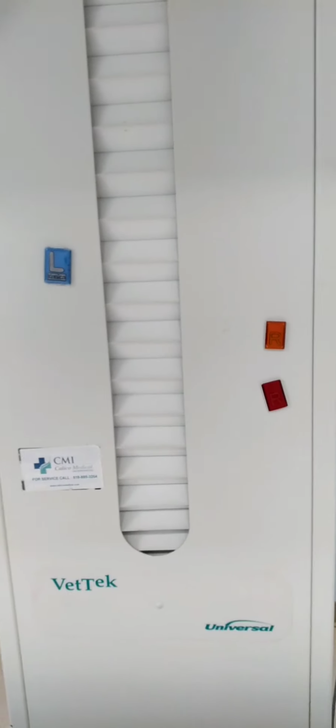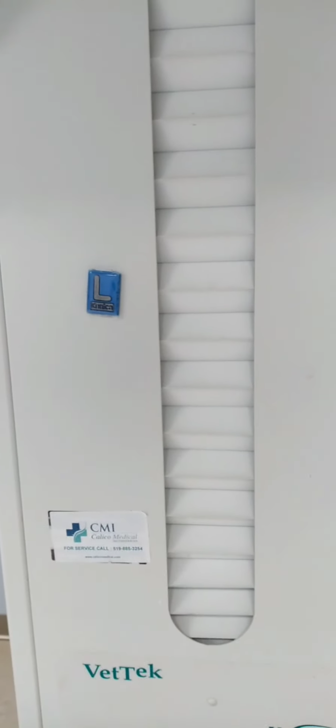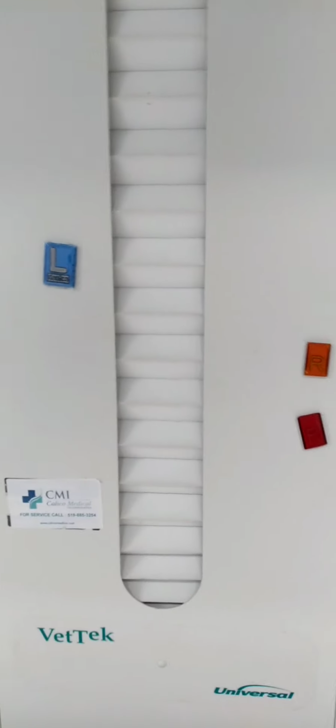Then the column is the back portion up here, all of this. On the column, you'll see there is one left marker and two right markers. They have magnets on them, so they're easy to find and so we don't lose them. And we usually place them on the back of the column.